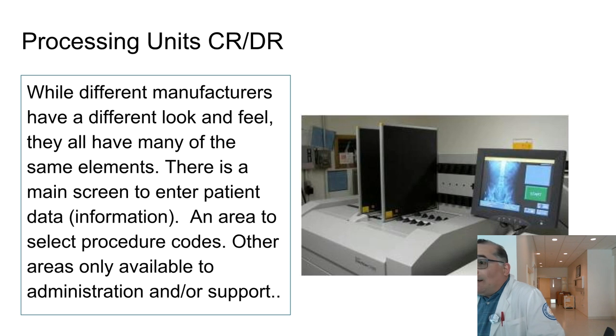We'll talk about speed class and what that means in terms of how it relates to spatial resolution, or resolution overall, compared to exposure. So a few things to talk about, including what happens when you use an extreme overexposure, which is what we were trying to do here in the lab, and we'll eventually try again.